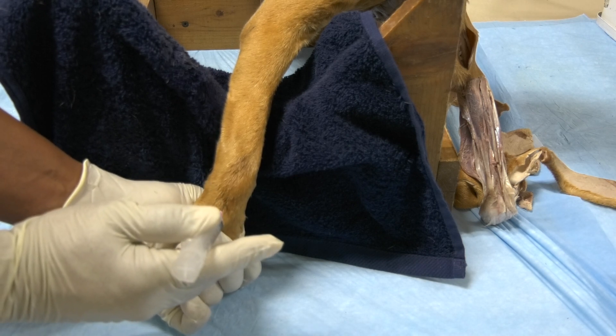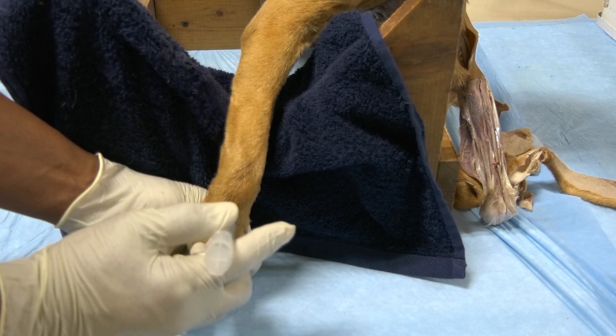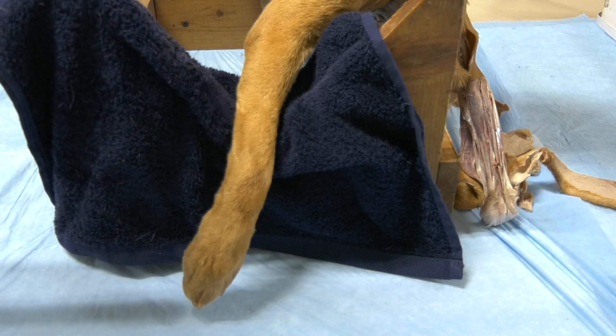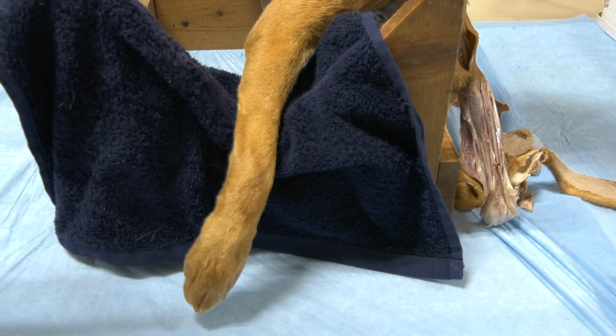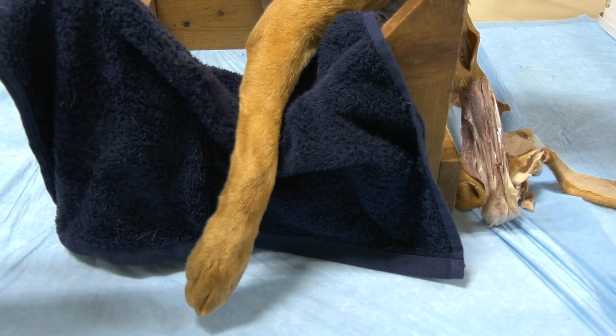The landmark for this one is a little bit challenging, so you need to take your time. This covers the arthrocentesis of the shoulder joint, the elbow joint, and the carpal joint. It is very important that you familiarize yourself with all the landmarks you will utilize to access the joint cavities of all these joints. Thank you.